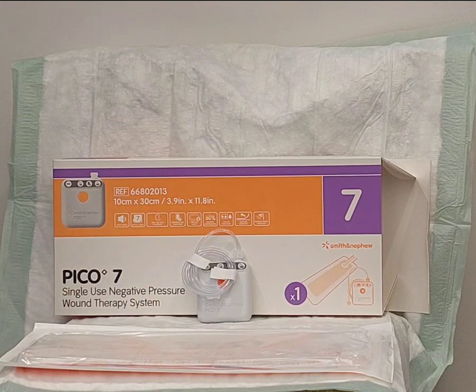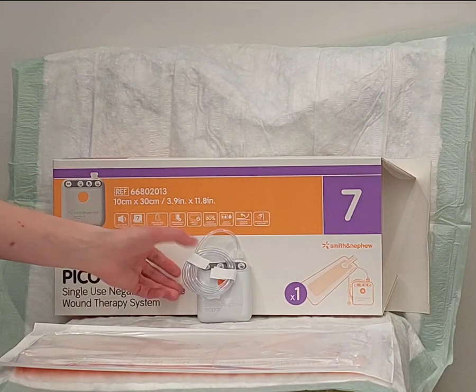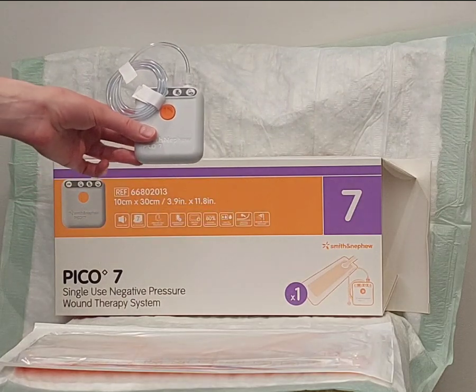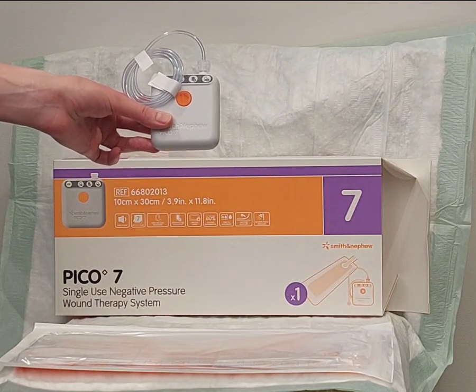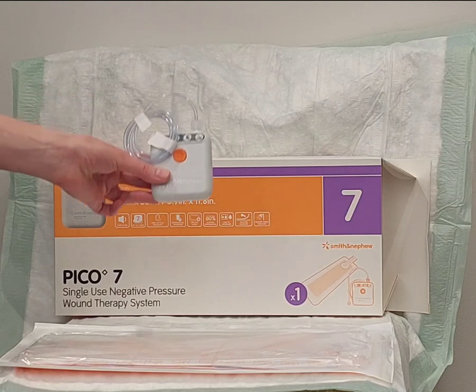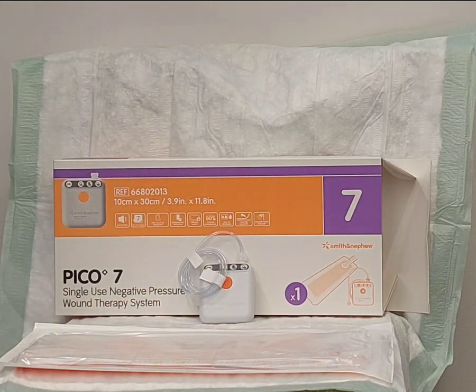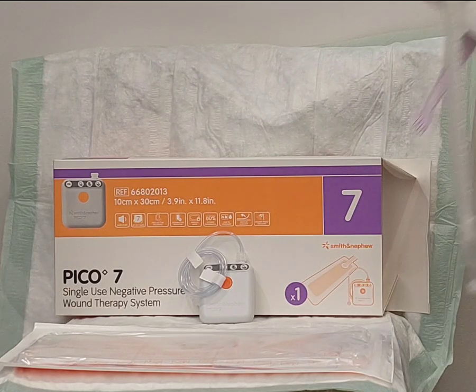It's really important to note that the pump contains a magnet, which means that it must not be placed close to other medical devices that could potentially interfere with. These include pacemakers, ICDs, insulin pumps, shunt valves, and cochlear implants. It's also not compatible with MRI, so the pump needs to be detached before taking a patient to MRI.